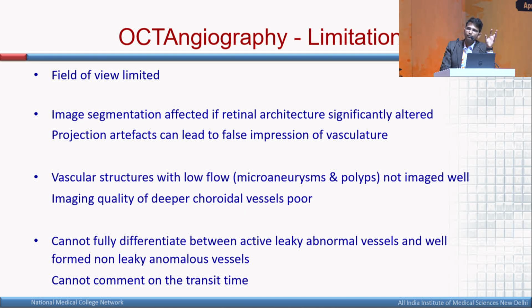And you cannot fully differentiate between an active leaky abnormal vessel and a non-leaky anomalous vessel, other than certain characteristic appearances such as a dead tree or a medusa head, but you cannot definitively tell whether they are leaky or not, unlike in fluorescein angiography. And also in inflammatory disorders, you cannot tell about the vascular leakage, which is of great importance in uveitis. And last, you cannot comment on the transit time, which is again important in vascular occlusions.